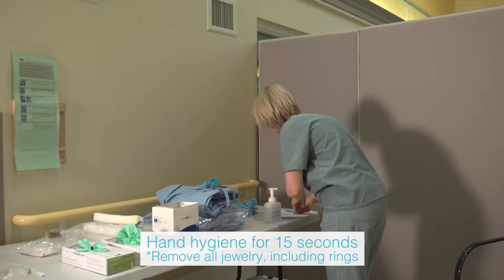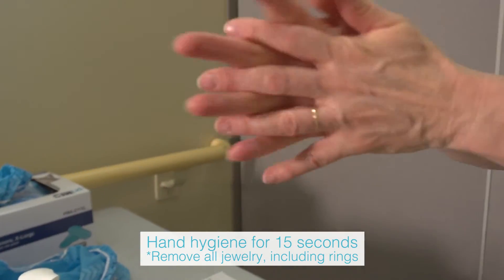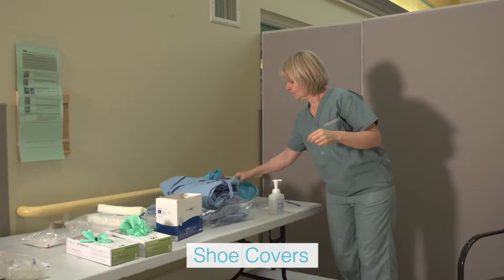Perform hand hygiene using alcohol based hand rub and allow hands to dry completely. Put on shoe covers placing on the toe and then the heel.